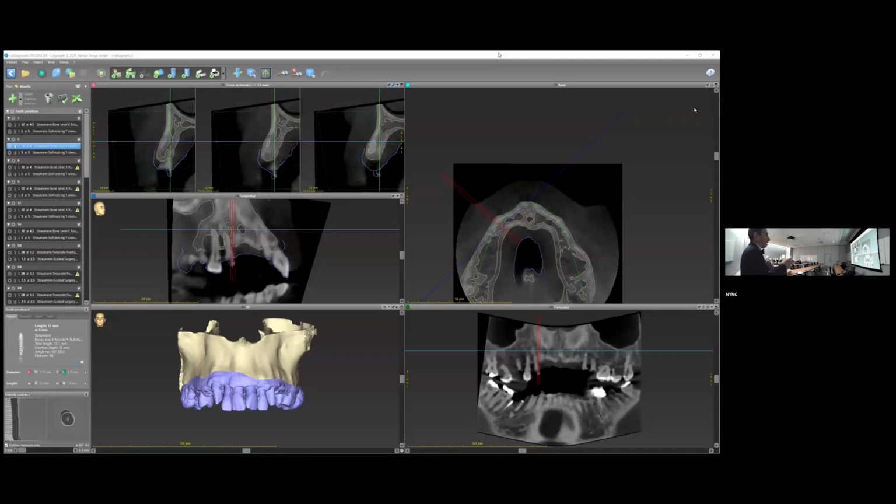So this is a newer technique where we have a patient that comes like this, where these are his teeth, and we're going to do what's called an all-on-6. What we're going to do is at the same day, we're going to remove all those teeth. We're going to adjust the bone, we're going to place the implants, and we're going to place a prosthesis all in one day. So we need to really know where exactly those implants are going to be and where the bone and the teeth are going to be.